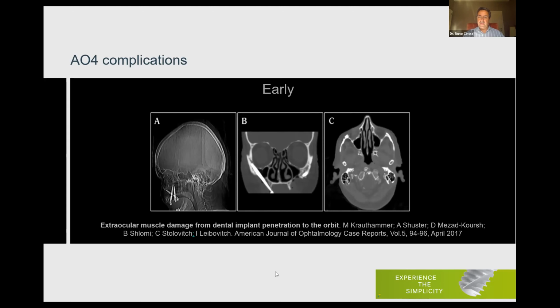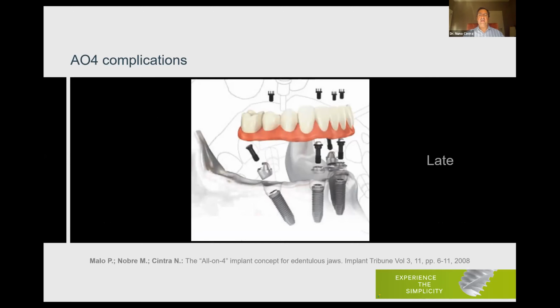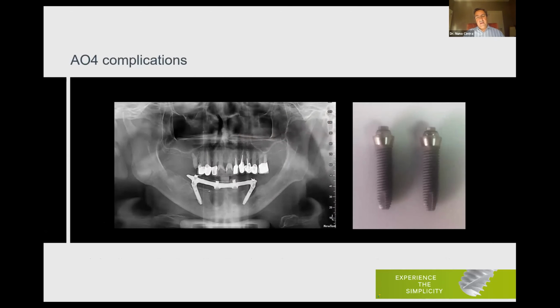And you see, very important issue. This was published not in a dental journal, this was published in the American Journal of Ophthalmology. So we are getting in trouble with ophthalmic surgeons. I don't want that. I try to avoid it at all cost. Late complications. Of course, again, screws can be a complication at a late stage. And if we don't have maintenance, of course, we can have surprises.